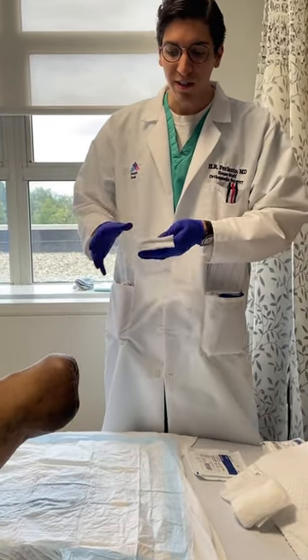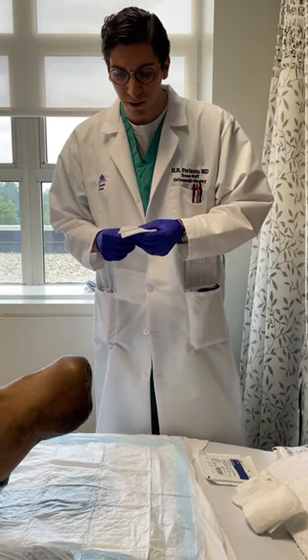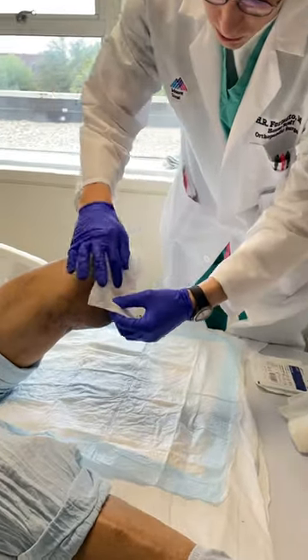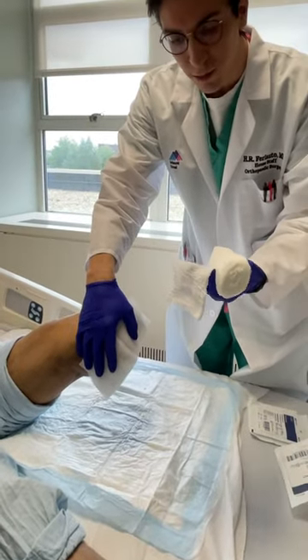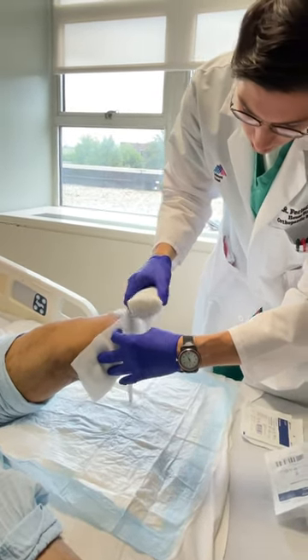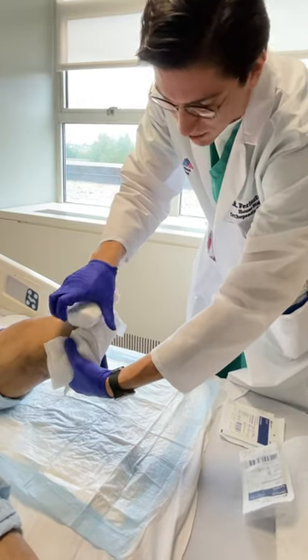It's also very effective at staying on and it doesn't slip off easily, which can be a problem with other dressing techniques. We start by taking some 4x4 gauze and just applying it over the raw areas of the wound, then we take a Curlex bandage and make a small tail and put the tail along the bottom of the stump, pinching it with the bottom of our left hand.